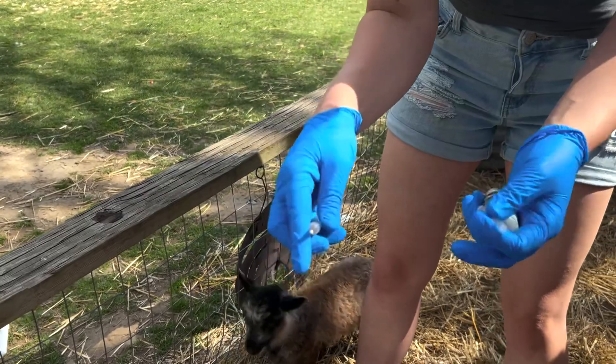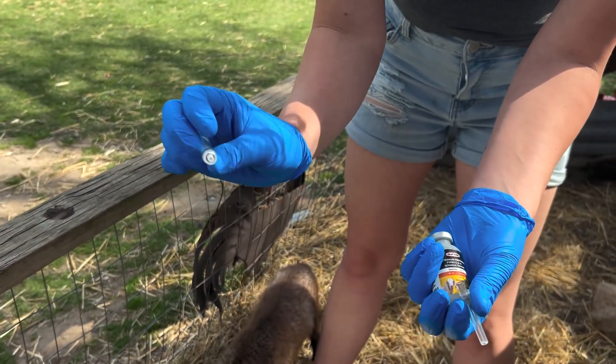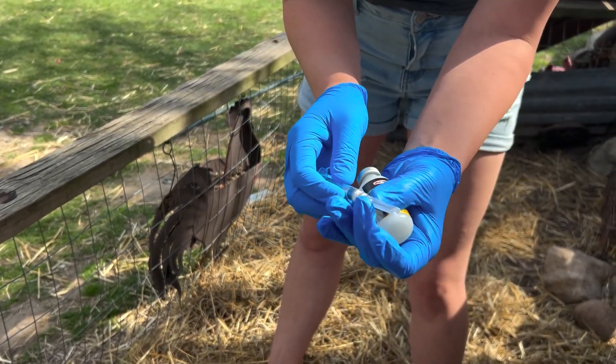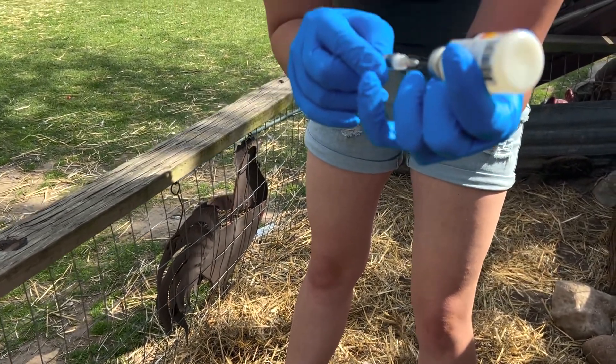In between every goat you want a new clean needle, and you can pop them off just like that. You can use the same syringe as long as you're using that same vaccine, but you do want a clean needle every time. You do not want to stick a needle back in that wasn't clean.